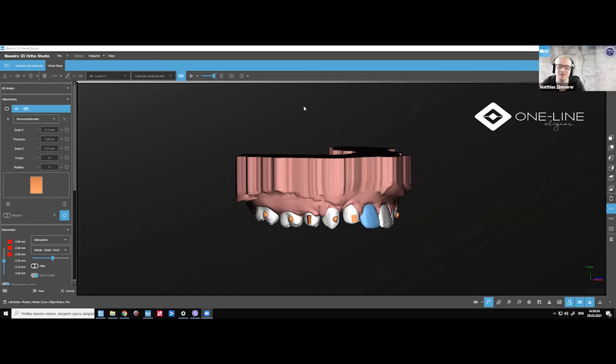It's your experience and it's your effort, and you have the knowledge of it. And how can a software handle this? I also think for some basic movements, yes. For example, if I will be making my software like Maestro, if I will work with Andrea, right? I will tell him, if you have a surface area, let's say in square centimeters, when you have a buccal surface area with minimum, let's say, 7 or 6 square centimeters, then we don't need an attachment, for example. If we have 4 square centimeters and it's round, we need one. So we can actually get to a point, yes.